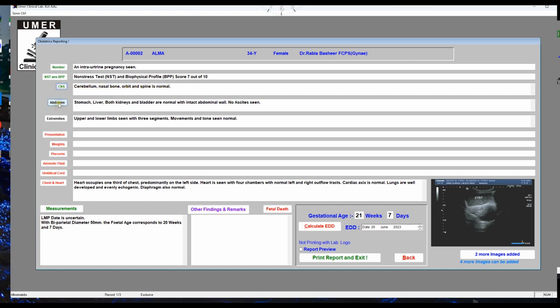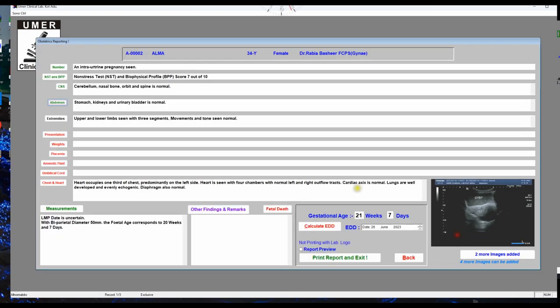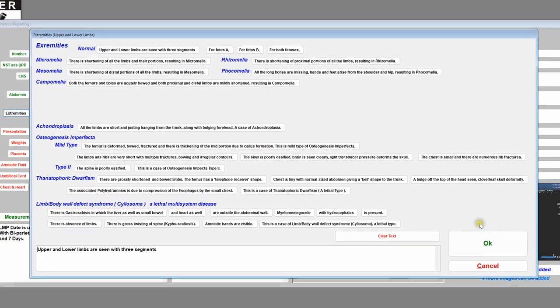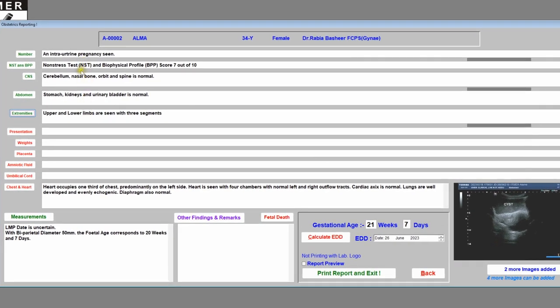Click 'Abdomen' — a screen pops up with all possible abdominal normalities and abnormalities. Suppose it is normal — click 'Normal' and click OK. Then click 'Extremities'. Suppose they are normal — click 'Normal'. All these fields are also manually editable if you need to write something specific.